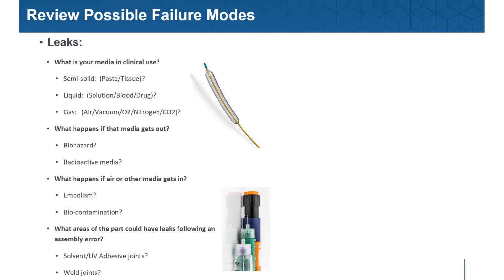The stretchy balloon catheters, maybe like a Foley catheter that's used in the bladder to retain position. Any position retention or occlusion type balloons that have highly elastic characteristics such as latex, which isn't seen that often anymore, silicone, or perhaps urethane. Those catheters are a nightmare. Why? Well, we pressurize them with air and they'll grow, but they don't just stop growing when we stop pressurizing. They will continue to stretch and move. And an ever-changing volume is a nightmare to try to do a fine leak test.